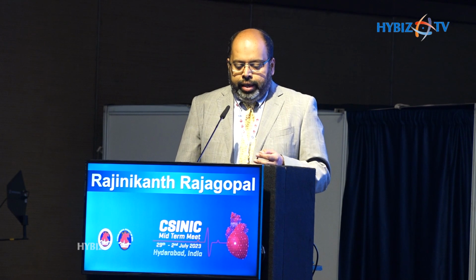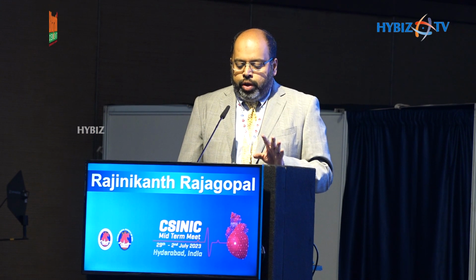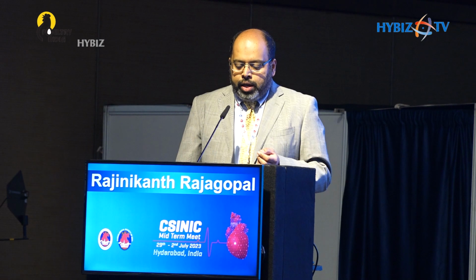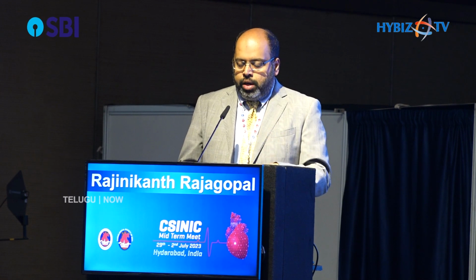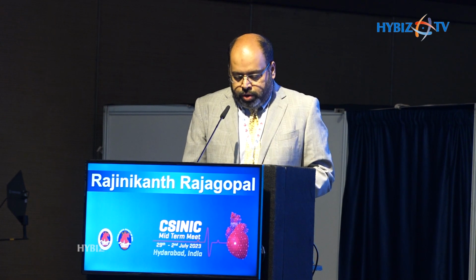And here you can see histopathology comparison with OCT. The neo-intimal hyperplasia is a homogeneous, bright, uniform layer, whereas neoatherosclerosis is heterogeneous, and you can see calcium and sometimes lipid pools. In stent under expansion, again, you see the stent itself is not fully expanded, on top of which you have tissue proliferation, you have neoatherosclerosis as well. As compared to the two on the left, where the stent is good, but it has got tissue problems.